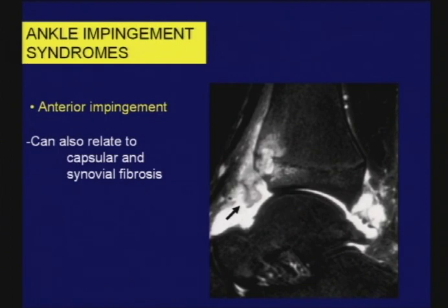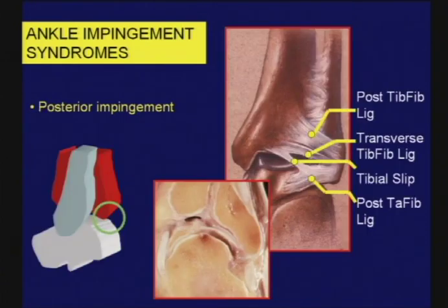There are some reports in the literature of the utilization of intravenous gadolinium first to define the extent of the synovial proliferation, and then through delayed images to provide indirect MR arthrographic contrast agent within the joint. I don't have any personal experience utilizing intravenous gadolinium or indirect MR arthrography, and frankly, I have very little personal experience with direct MR arthrography for this condition.